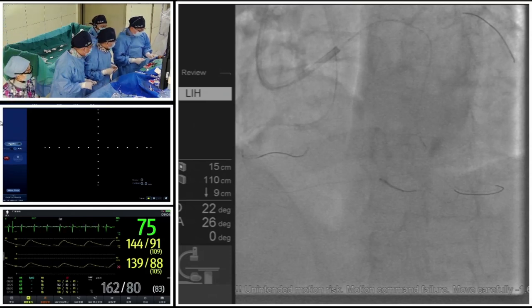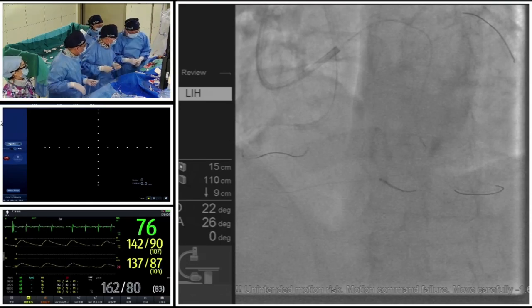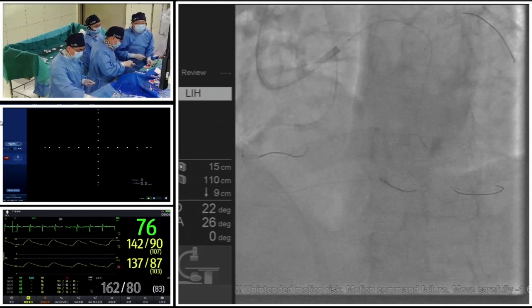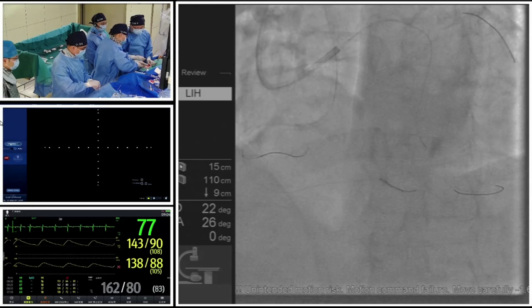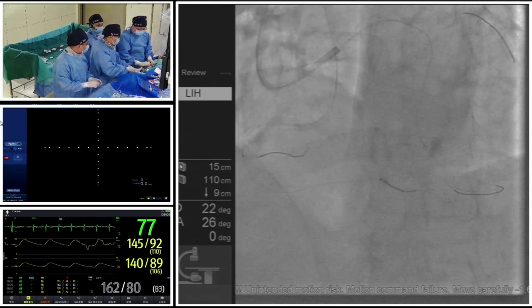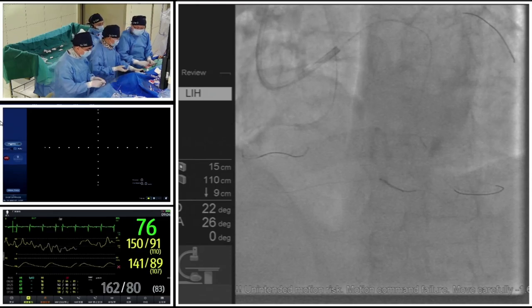We can see some staining in another sub-branch, although it's benign because it does not cause a tamponade most of the time. However, balloon dilation or mistaken microcatheter push forward might cause septal perforation or epicardial collateral perforations. This is great damage and high risk for the CTO procedure. Sometimes it may stop the whole procedure because of this septal damage, and coronary perforation is one of the most feared complications of CTO PCI.